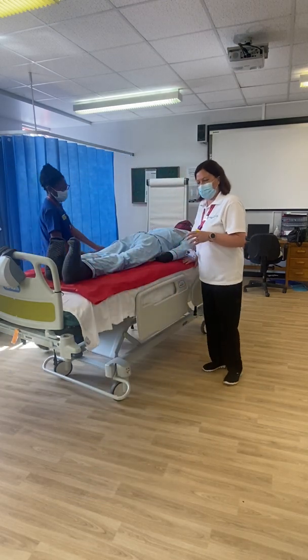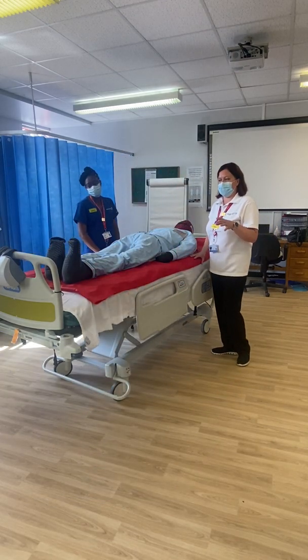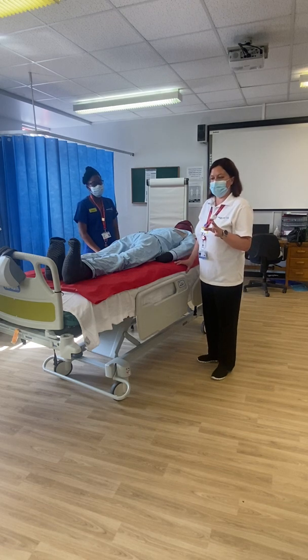So that's a method of getting the slide sheets in underneath your patient if they're very large or not able to roll. Thank you.